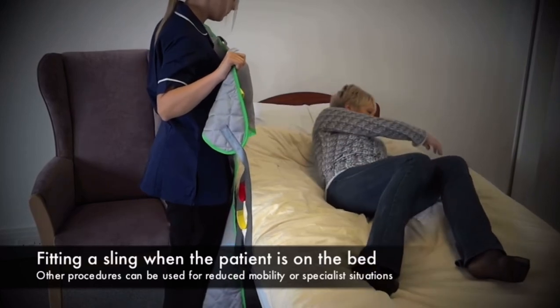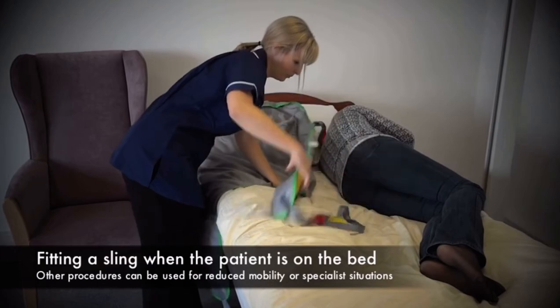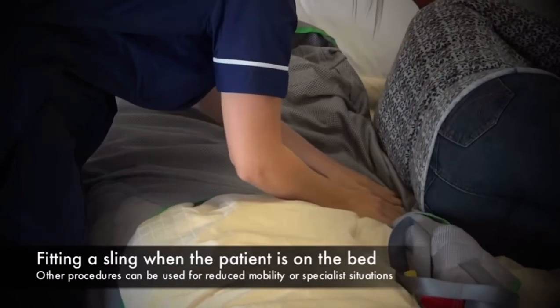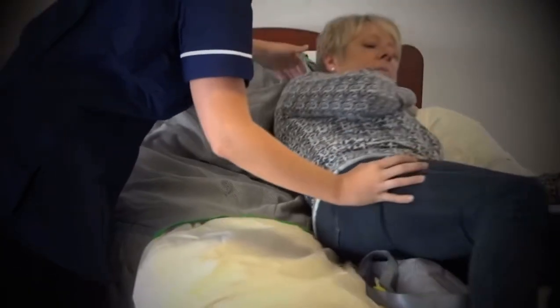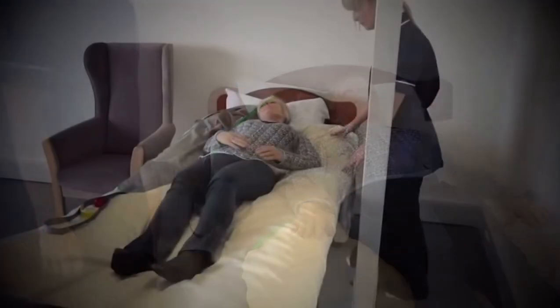We're going to introduce a sling to a client who's lying on the bed. The client is rolled over to one side, the sling folded and introduced with the aperture just around the coccyx area, and then the client is rolled back over into the middle and then to the other side.